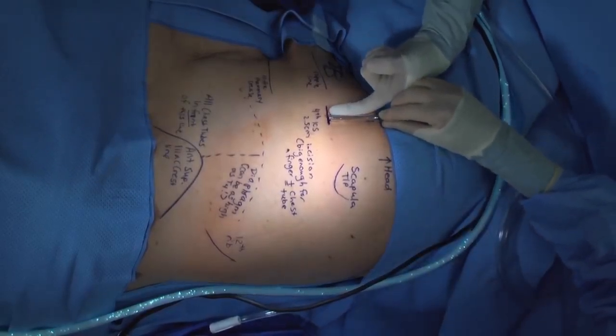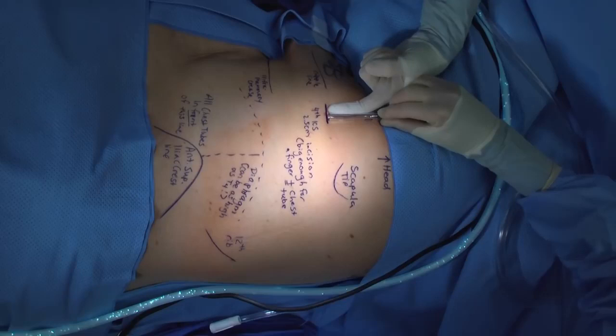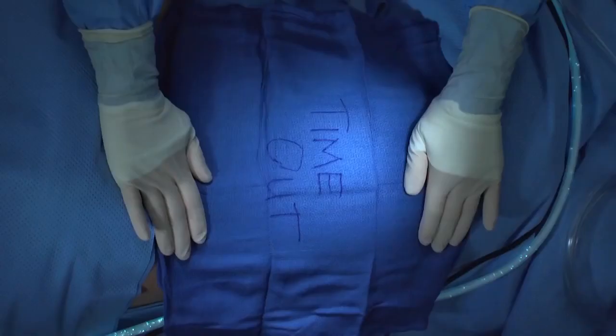Note that our incision is going to be approximately 2.5 centimeters, maybe a little bit larger in some patients, to allow careful insertion of the chest tube. The timeout is essential. Verify your patient, laterality, that you have all of your equipment, and that you have adequate help in the room. This is a point at which you can have your assistant start setting up the atrium. Remember, an extra set of hands to help prep, drape, hand your instruments, hold the chest tube while you're securing it into place is always a great idea. Always take someone with you if you can.